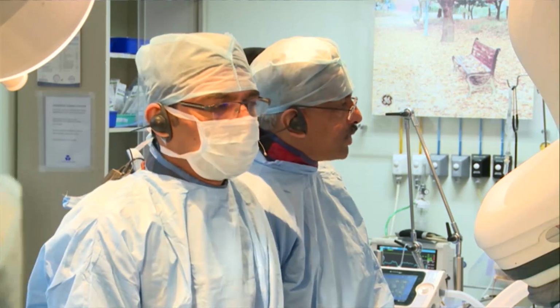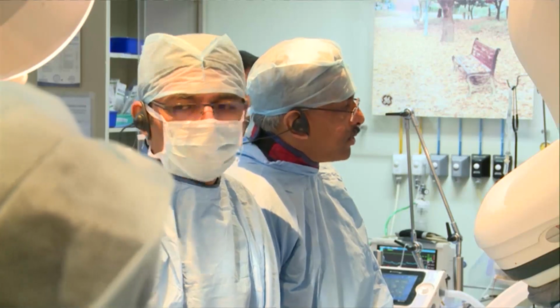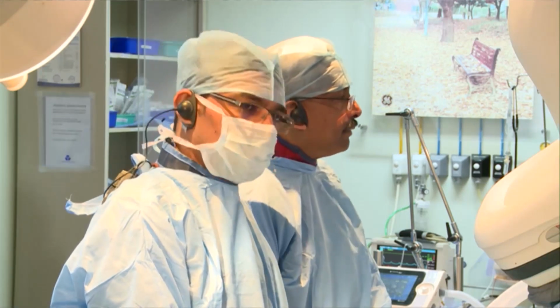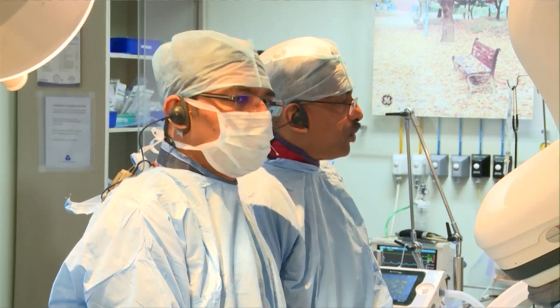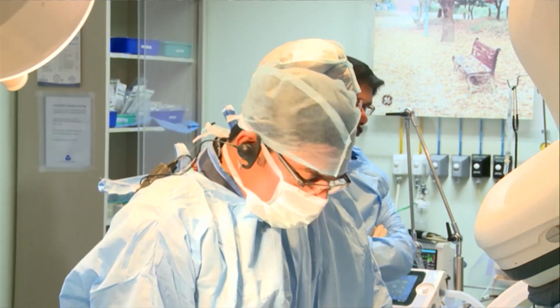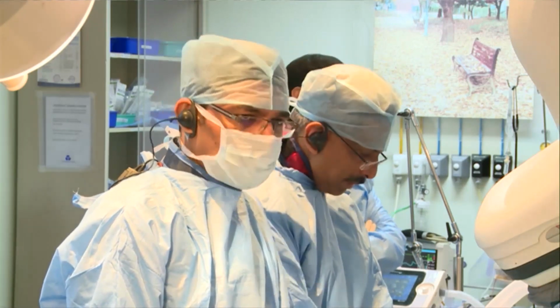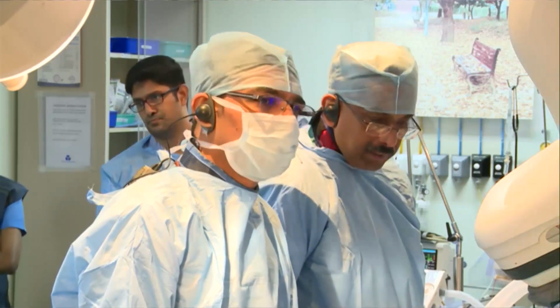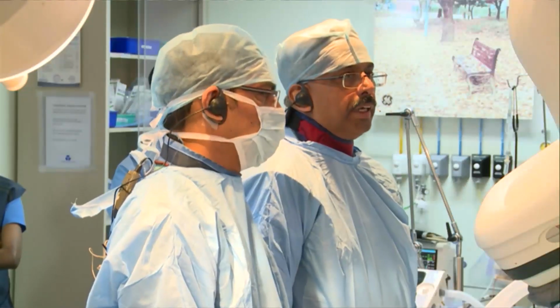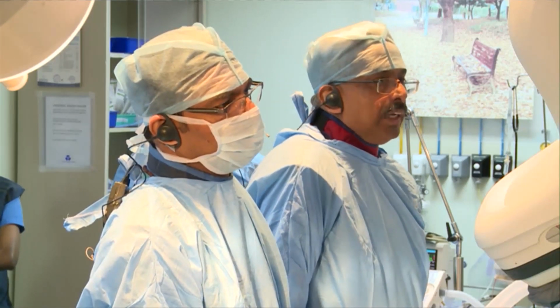For 4 days the patient was on the pump, after which the pump was removed, but the patient continued to have breathing difficulty and continued to require non-invasive ventilation. So the plan today was to look at what we did to the OM and then look at the LAD lesion and plan what we could do for him. Maybe as we get everything ready, I would like the opinion of Dr. Ailan, Madhavan and Mehboob of what they would plan to do if we had to take this patient in for a procedure today.